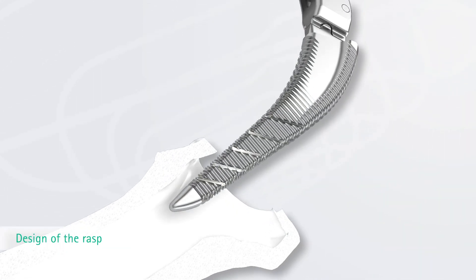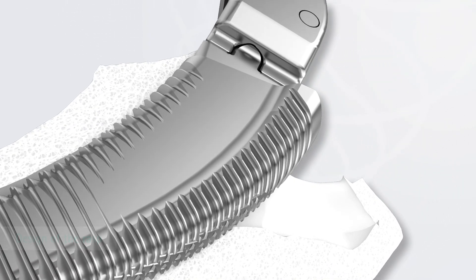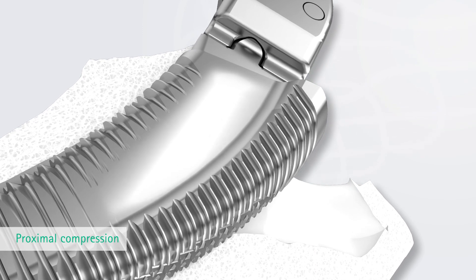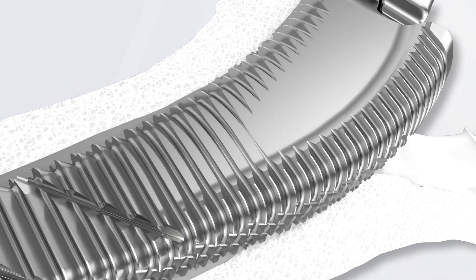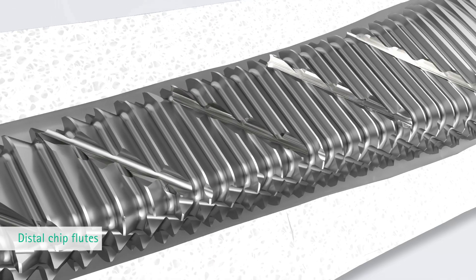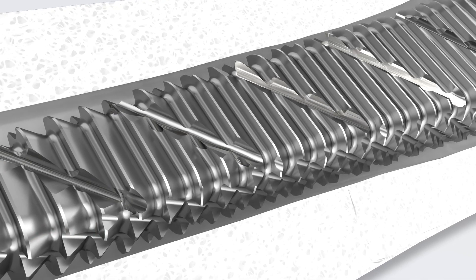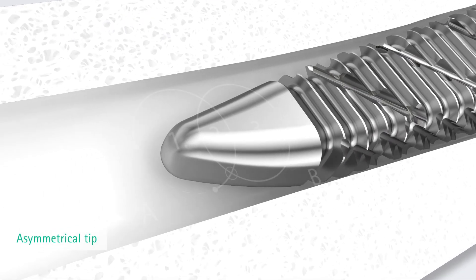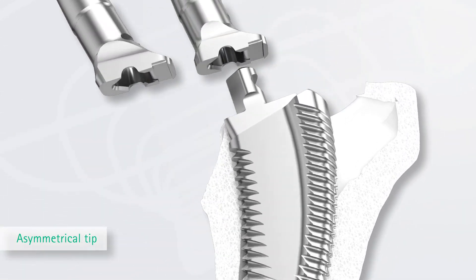The design of the rasps allows for a smooth preparation of the implant bed. Proximal compression planes of the rasps support compaction of the cancellous bone in anterior and posterior direction, and herewith the preservation of bone material. The rasping is supported by chip flutes in the distal part of the brooches, which also facilitate the cleaning of the brooches from blood and bone material. The asymmetrical tip of the implant and the rasp prevent distal lateral load transmission and provide intramedullary guidance of the rasp during implantation.